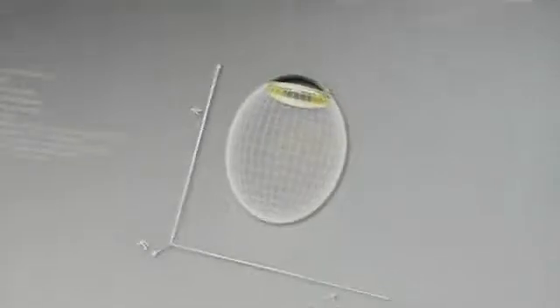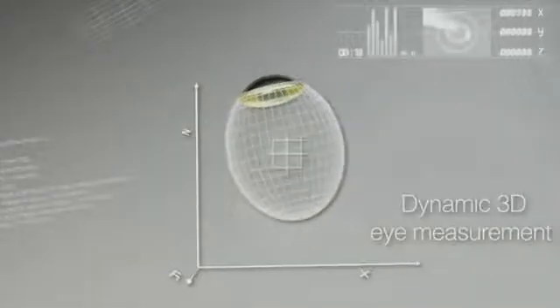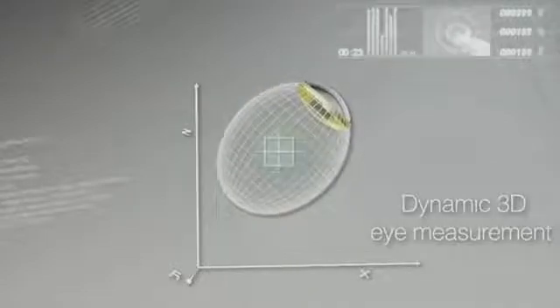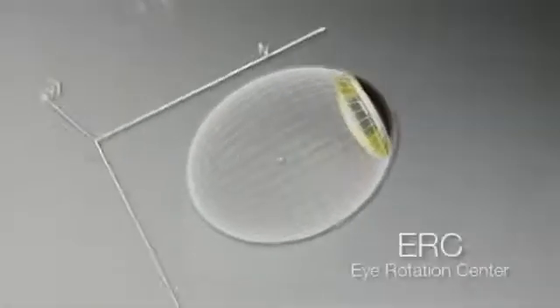For the first time, a live three-dimensional measurement of the human eye can be performed in your office, quickly and accurately. This dynamic 3D measurement determines the exact spatial position of the eye rotation center, also known as the ERC.